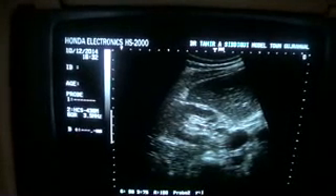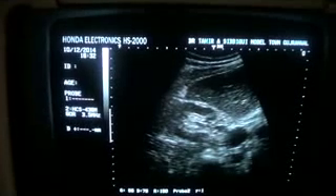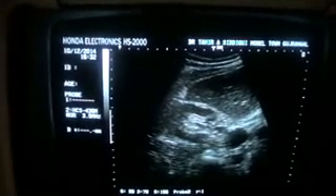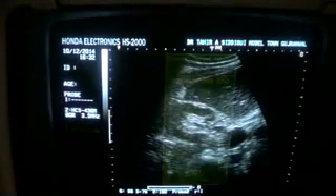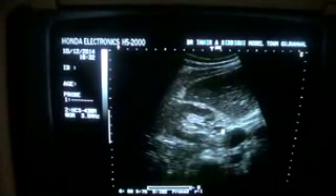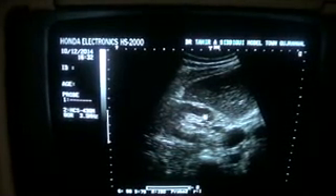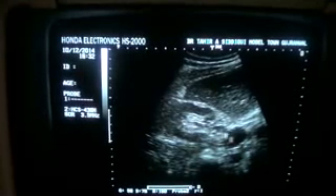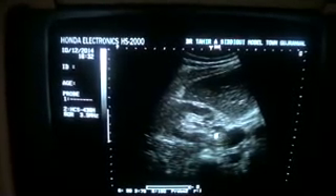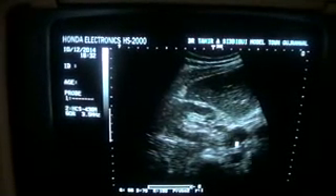If you don't see any calculus in this view as well, then there is no calculus in the kidney — you can be rest assured about that. Don't label a concretion, which is normal here as I see in the image, as a calculus. Concretion is less than 5mm.